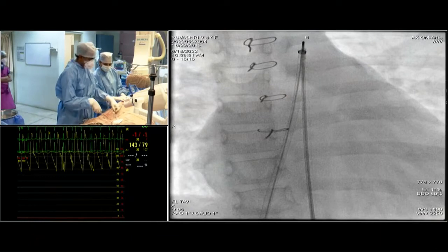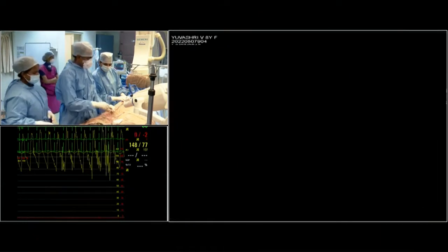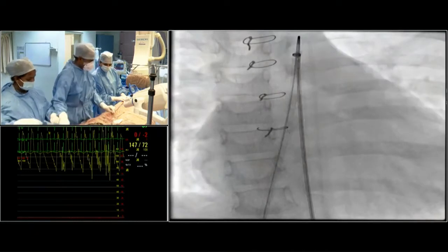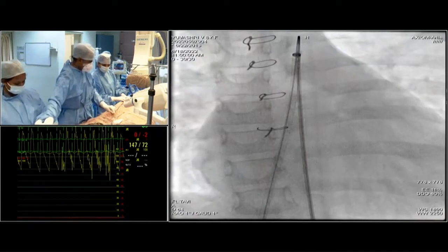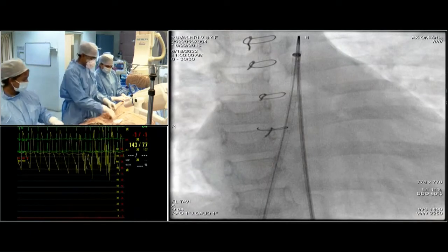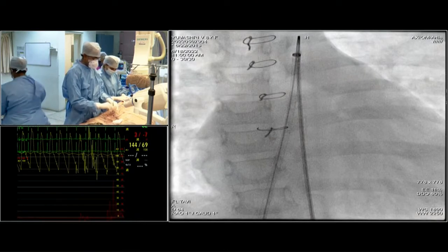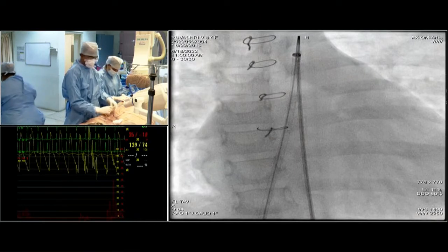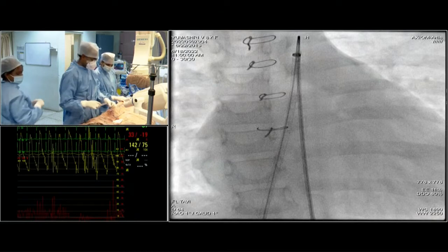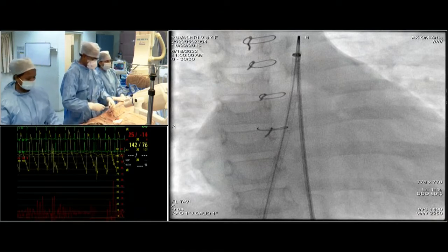What we are going to do now is connect the aortic sheath sidearm to pressure monitoring, so I will know when I am transitioning from the aorta into the right atrium. I am connecting this to the pressure line now.